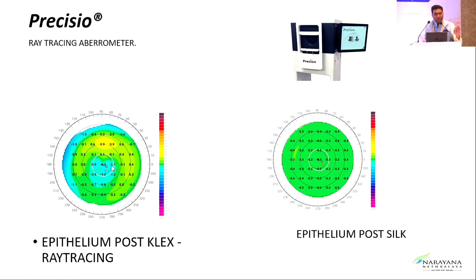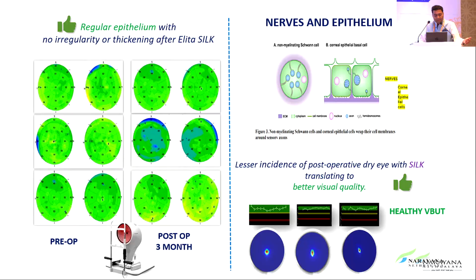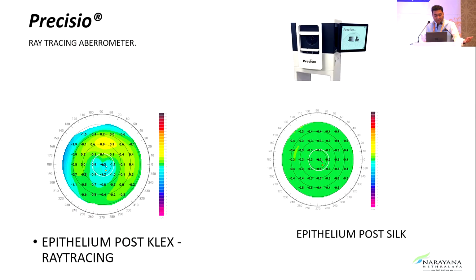And what is important is, when I started looking at more and more LASIK and non-properly healing epithelial maps, you see a lot of ray tracing changes, which we were never able to pick up because most of the time epithelial maps come like this. It doesn't give you a refractive map, it's a thickness map. But when you start comparing the real thing, I told him your problem is in the epithelium. It's not the surgeon. I've never seen such a beautiful surgery. I told him I would be so happy.